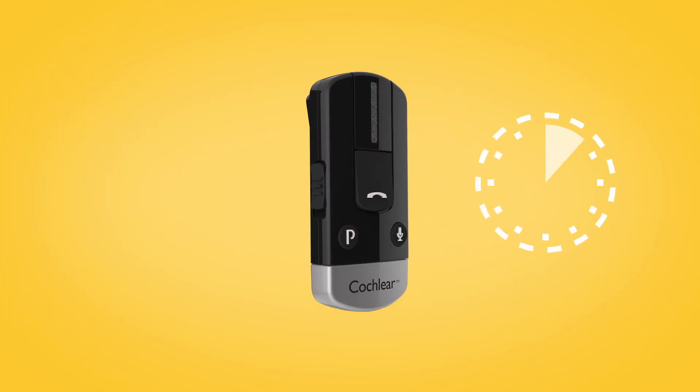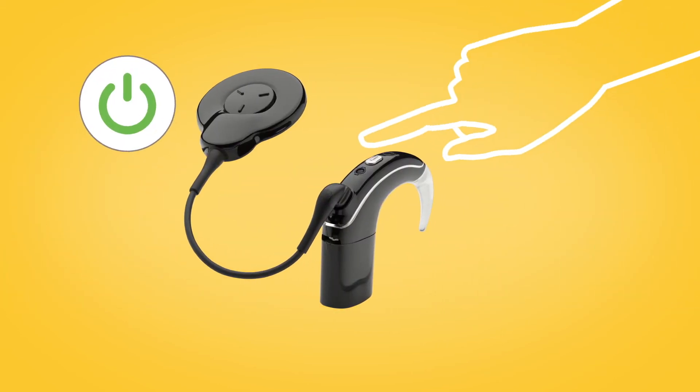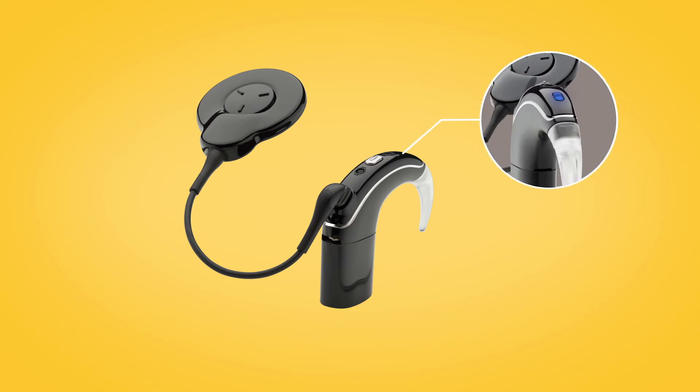Pairing mode lasts for 20 seconds, during which you should switch on your sound processor. Your sound processor will briefly flash a blue indicator light to tell you it has successfully paired with your phone clip.